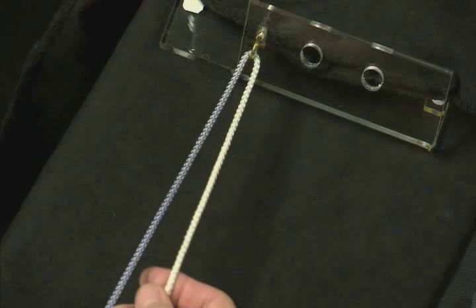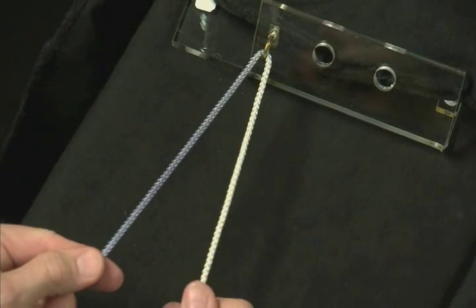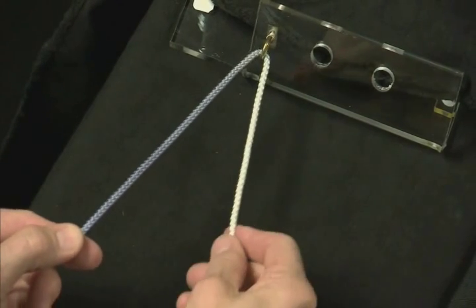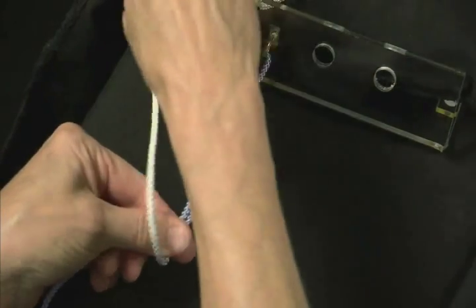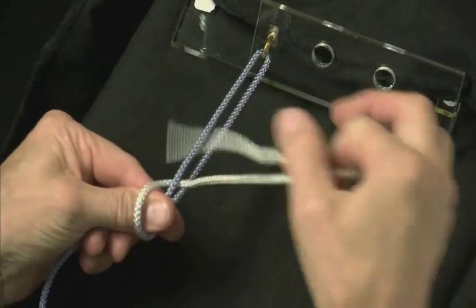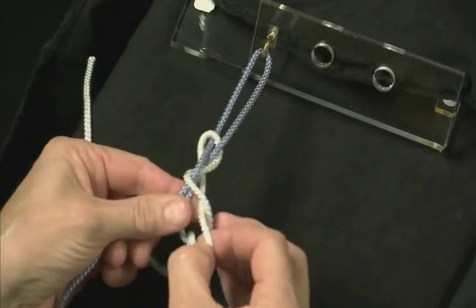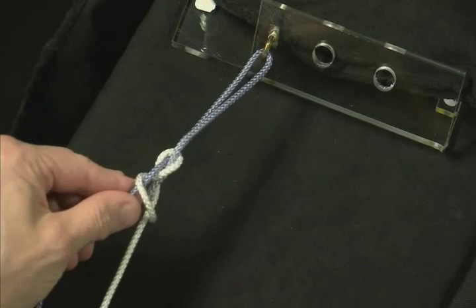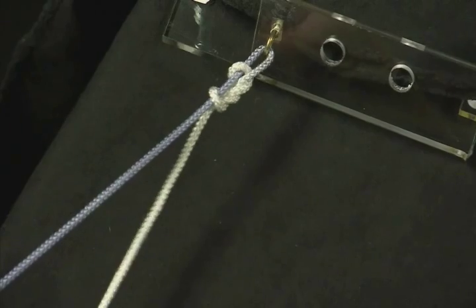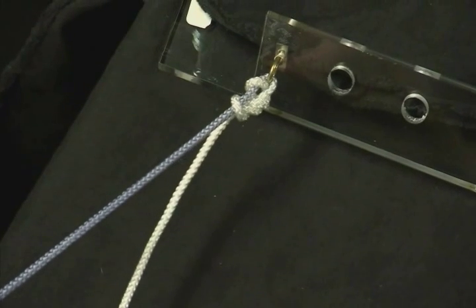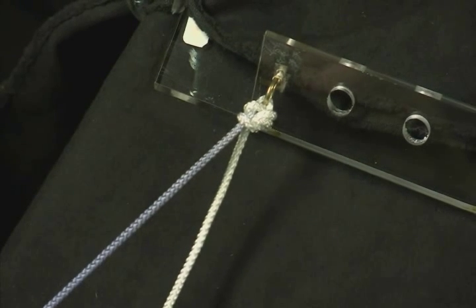Next, Dr. Ireland demonstrates the Westin knot. So the Westin knot, my post is in my left hand, it's blue, wrapping limb here. Bring this down where the post is half of the other suture. Bring it over my thumb, over the wrapping limb, back through the loop. And then as you watch the suture come down, it's a sliding knot, right? So we're going to even up our post and wrapping limb, come down to the base. And as I'm pulling on it, you can see it seats itself.